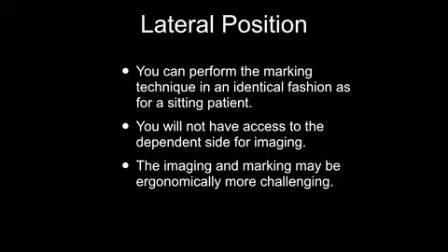Often, a patient cannot be placed in the sitting position to perform a spinal using the marking technique. If a patient is in the lateral position, you can still perform the marking technique in an identical fashion as compared to a sitting patient. Of note, you will not have access to the dependent side for imaging. Additionally, the imaging and marking may be ergonomically more challenging.